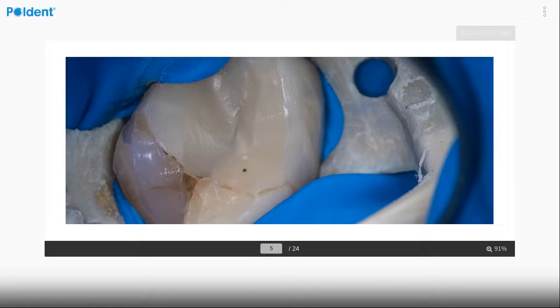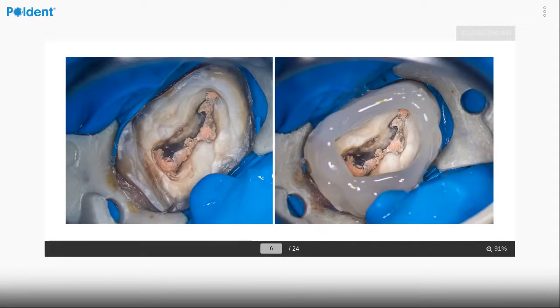But on the other hand, there are some important factors such as removing caries, and sometimes after removing caries, your tooth can look like this. Of course, I know that's a kind of compromise, but still we know that in many cases we have to deal and treat also cases like this and try to give a second life, the prosthodontic buildup, and we pray every year for another recall X-ray, which will show healing and no symptoms of vertical root fracture, for example.